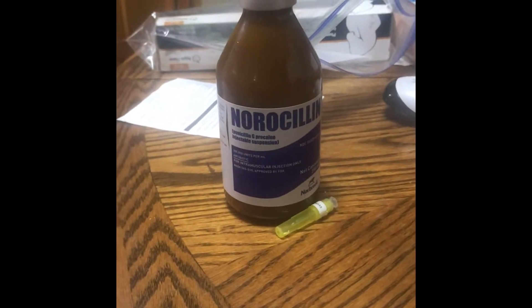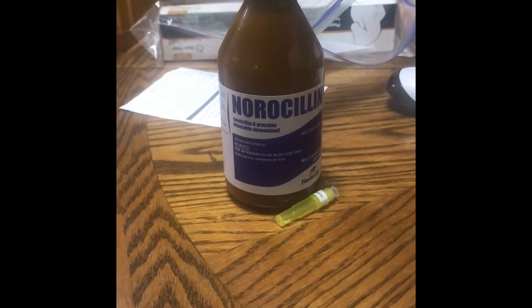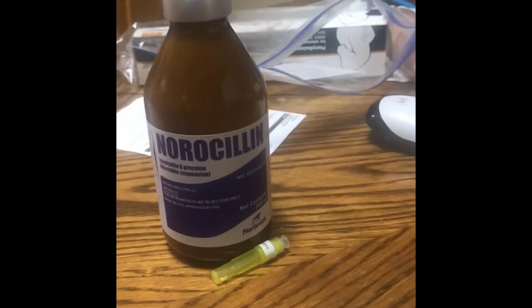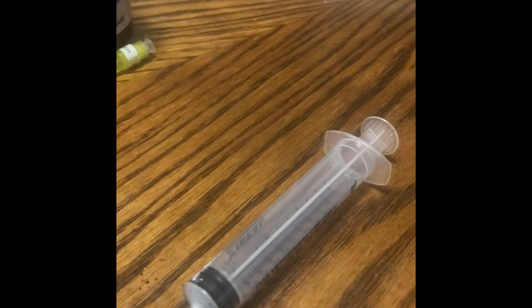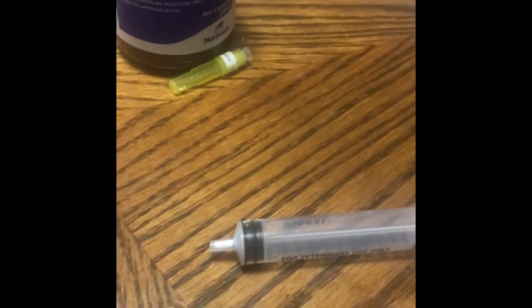Hello, I'm going to show you how to do an intramuscular injection on an equine. The things you're going to need are your medication, a 20 gauge needle, and at least a 12cc syringe. This is just what you're going to need for this part, not including your horse, halter, and stuff like that.